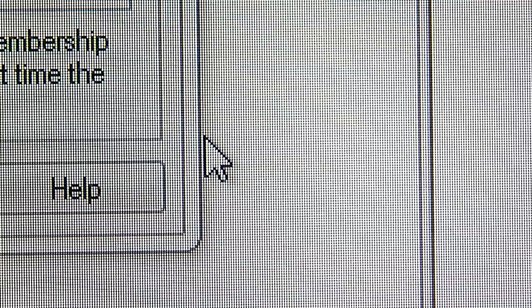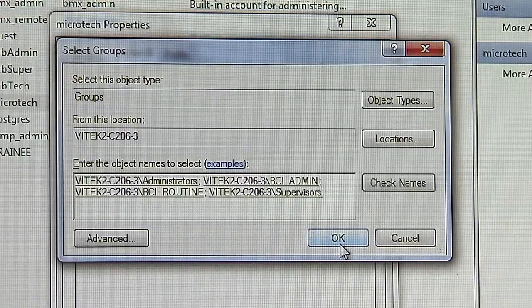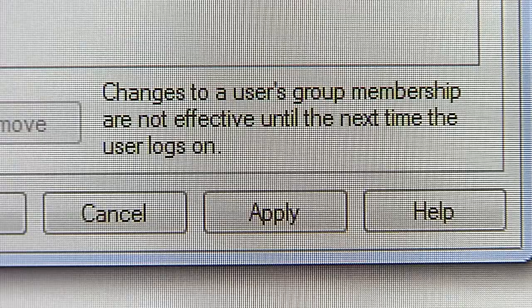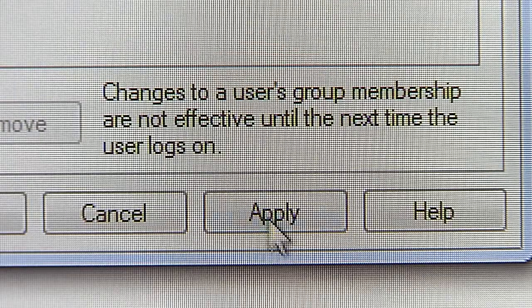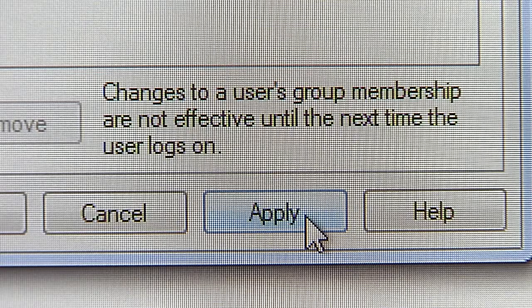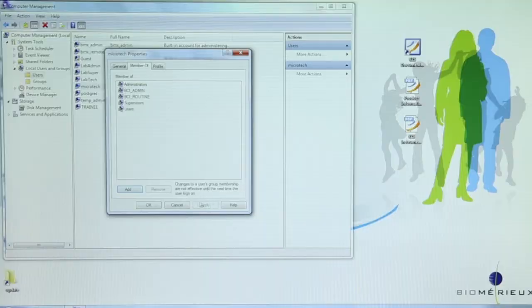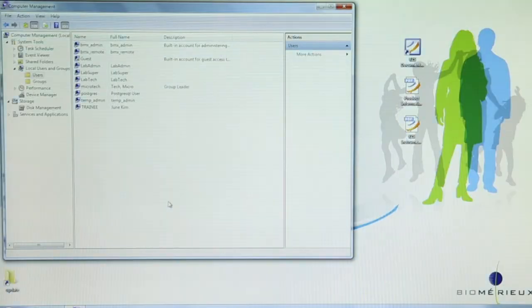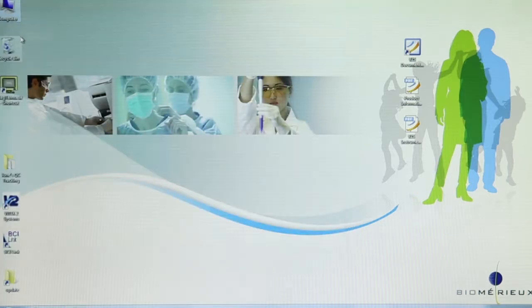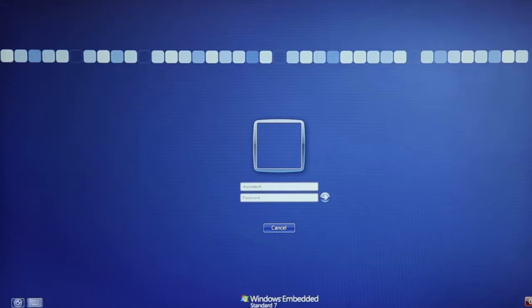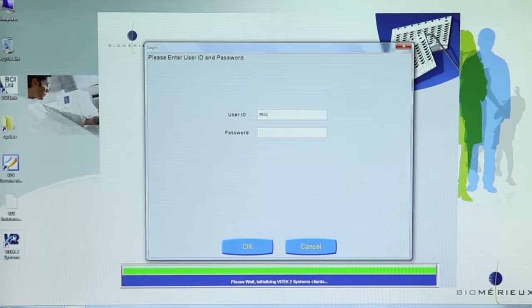Click the OK button. Click OK again. Click Apply. Click OK. Select File and Exit to return to the Windows desktop. The user name can now be used to log in to both Windows and Vitek 2 system software.